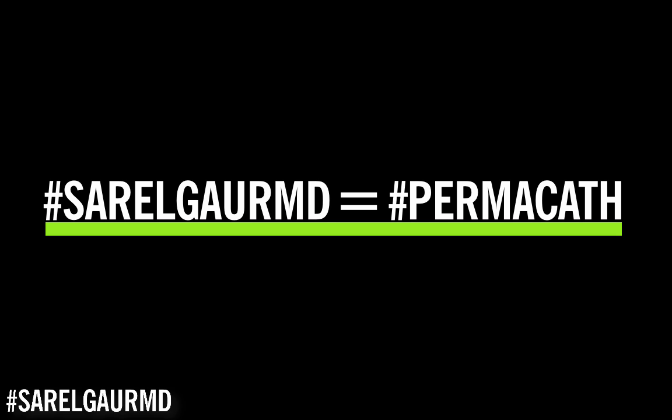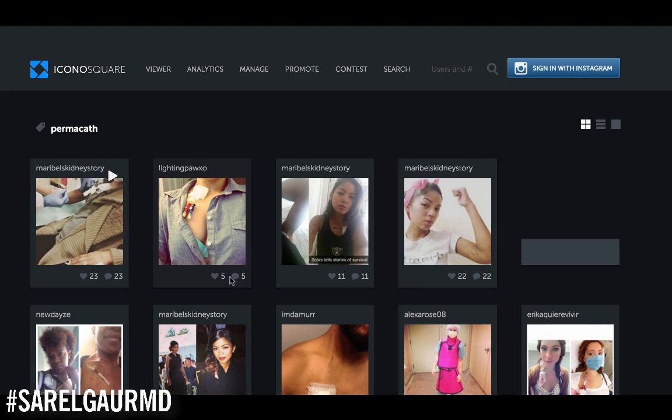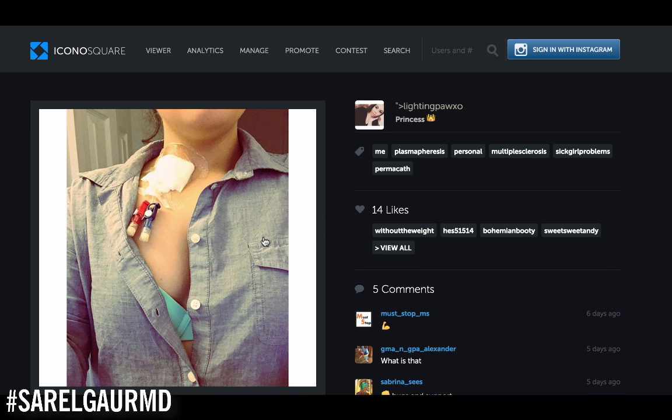Let's take a look at a permacath in situ. Here you can see the two lumens of the catheter — the arterial lumen and the venous lumen. This big dressing here is covering the subcutaneous track that the catheter takes from the right chest into the right neck. From here the catheter goes deep into the neck into the internal jugular vein, where the tip of the catheter is going to be somewhere in the SVC cavoatrial junction.